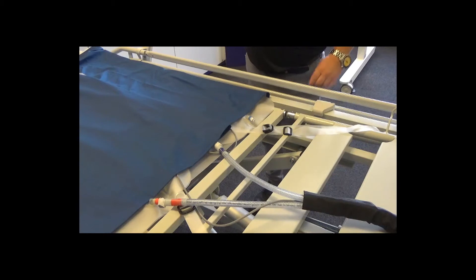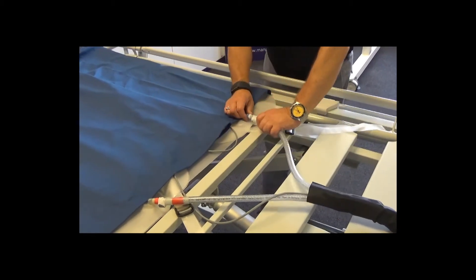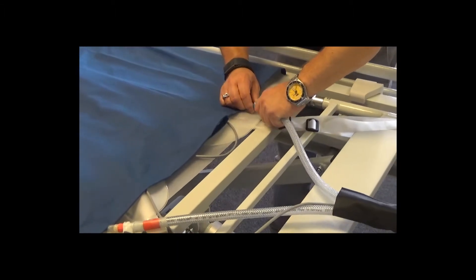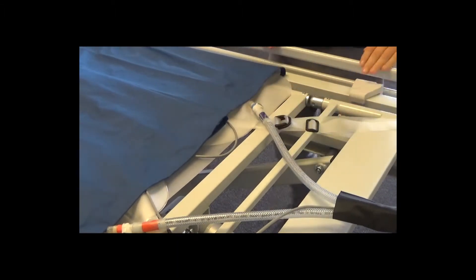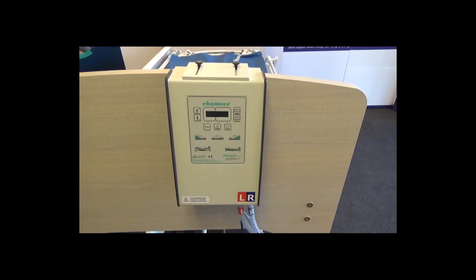The next step is to attach the air tubes to the lower end of the air chamber system. The left tube should attach to the left air bladder and the right tube to the right air bladder. The air tubes are marked red and blue to denote left and right, and this corresponds with the marking on the control unit.